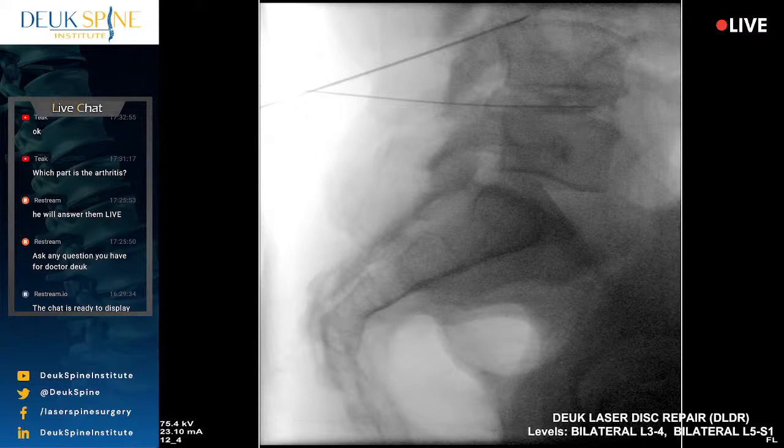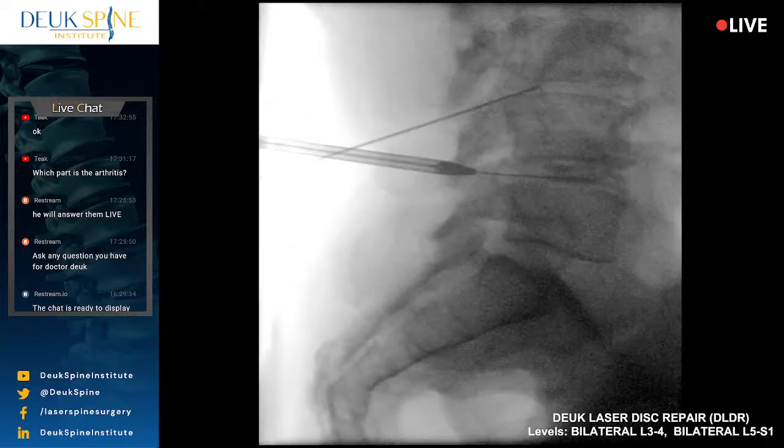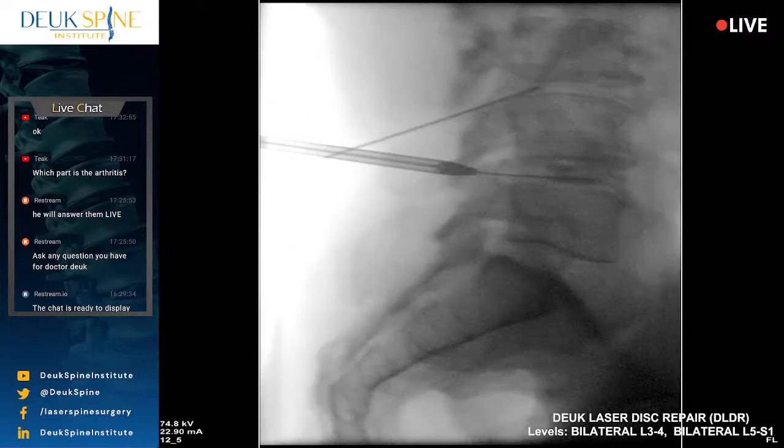Somehow it's working. You're too south. Shot. So you're too south again. I would just move slightly more north.